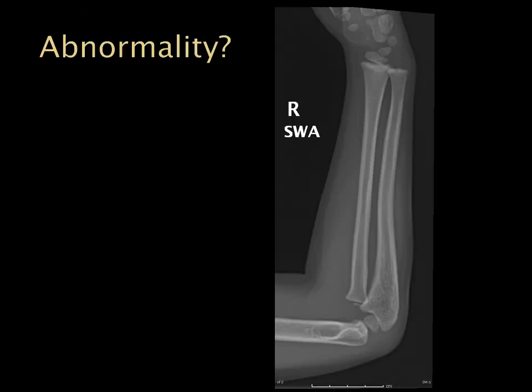We'll end with one more abnormality. Even though it's a forearm x-ray, we still want to make sure that we have radial capitellar alignment — and this is radial head dislocation.